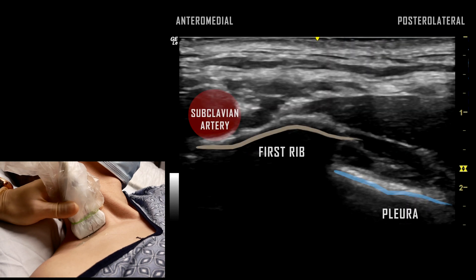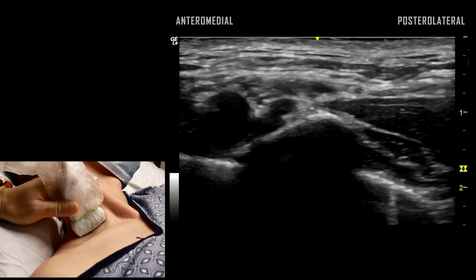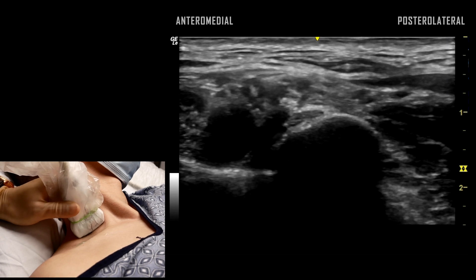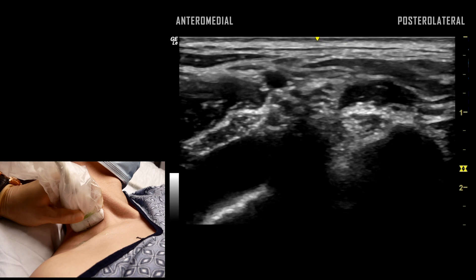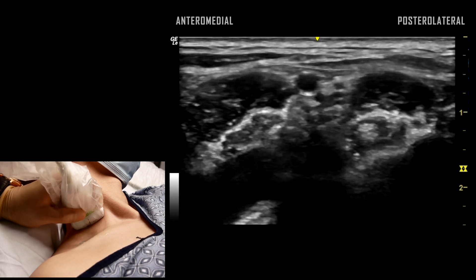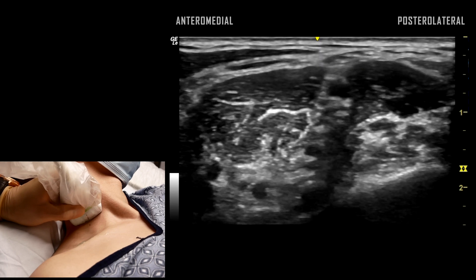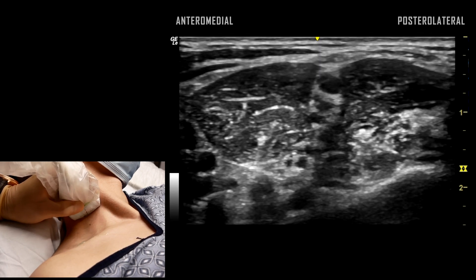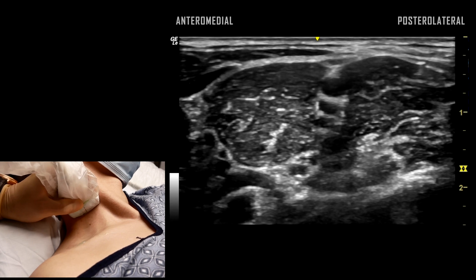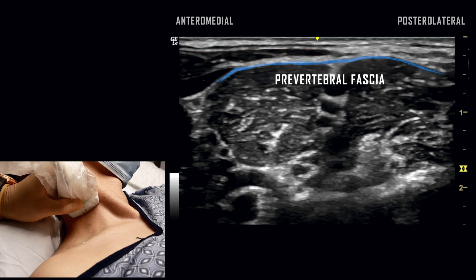This view is similar to the scan for the supraclavicular block. The probe is slowly translated cephalad to identify the anterior and middle scalene muscles with the brachial plexus located in between. The sternocleidomastoid muscle and prevertebral fascia are visualized superficial to the brachial plexus.